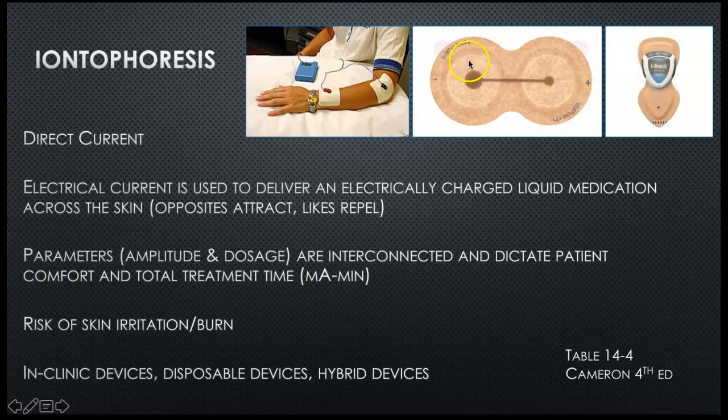And then there are fully disposable ones where you put the medicine on. See, they all have a positive and negative side. You stick the medicine on depending on what you want. And then you put it on the area that you want treated, and the patient can just leave. And you tell them to wear it for so many hours, and then they leave. They take it off at home.